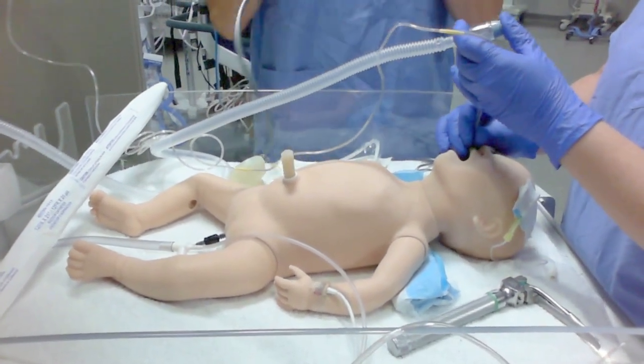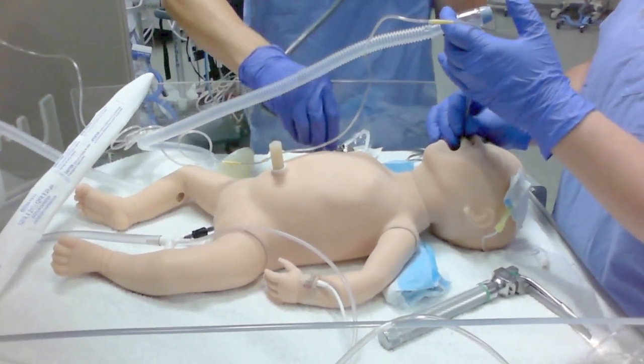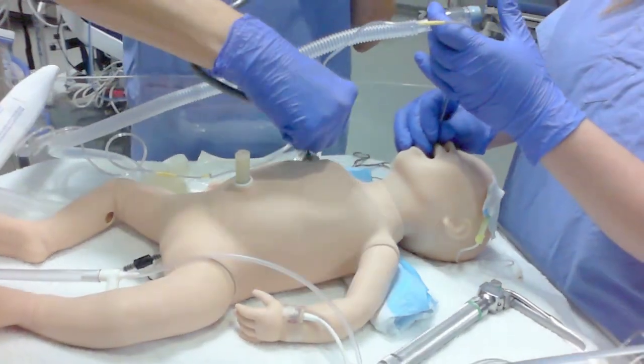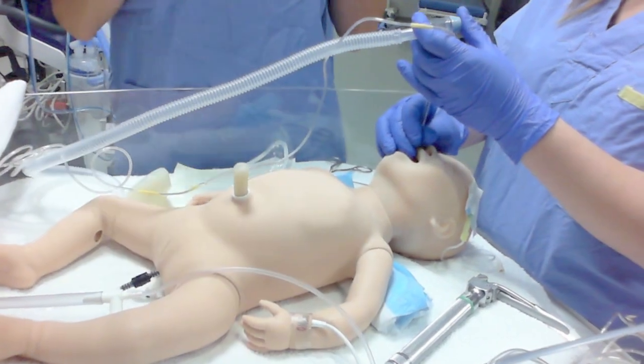I see chest rise. I see misting in the tube. I see end tidal. I hear equal and bilateral air entry.